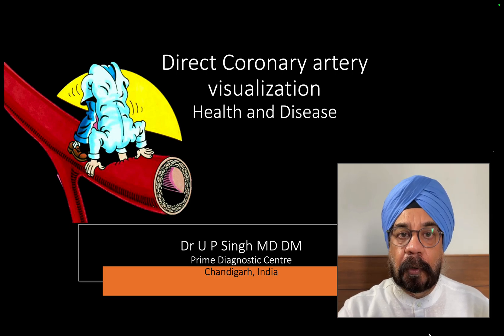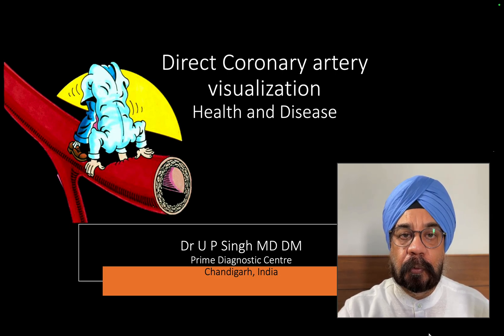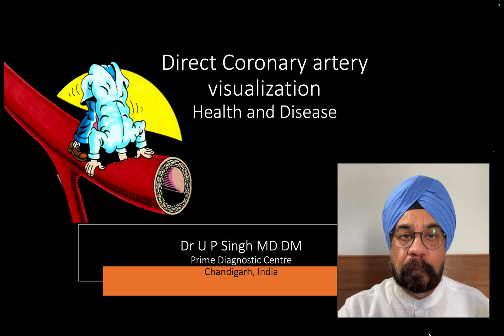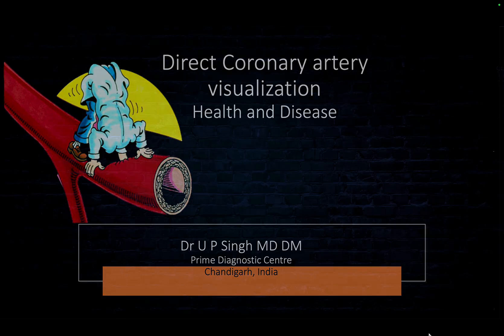This is a video in a series where I want to show you the coronary arteries in health and disease, right from the fetal circulation to the adult circulation. I am going to focus a bit on the fetal circulation in this video.